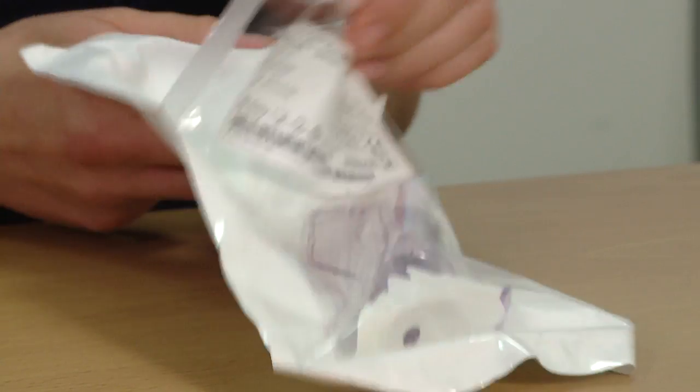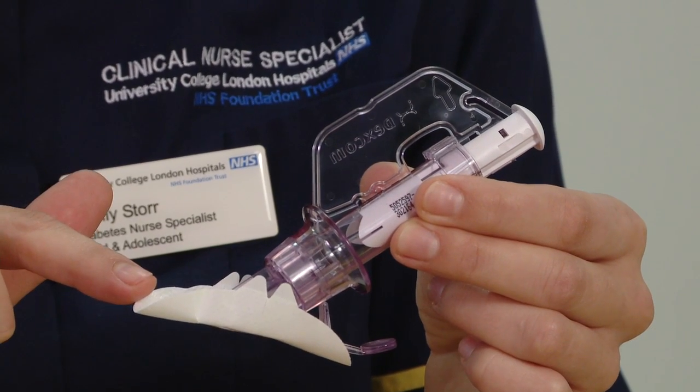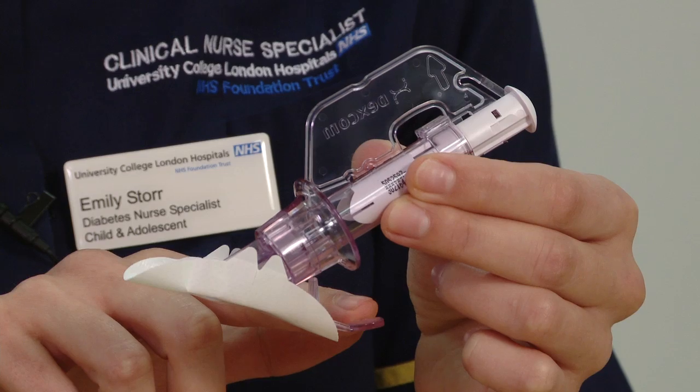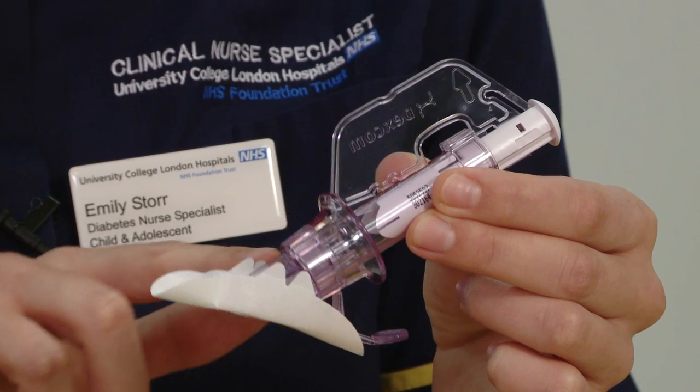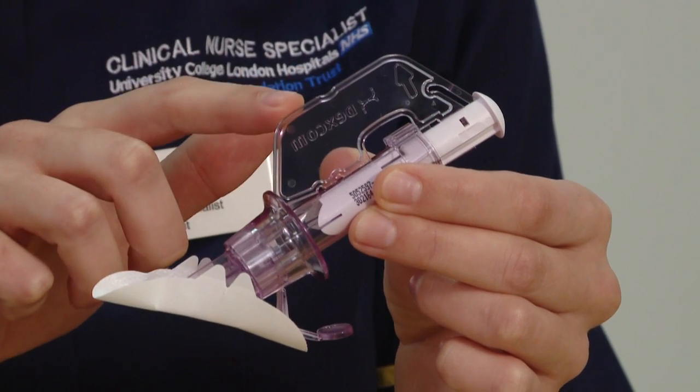I then need my sensor applicator. The sensor applicator consists of the sensor, the transmitter latch, the collar, the plunger, and the safety guard.